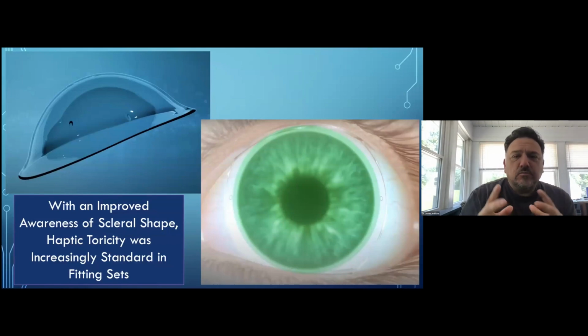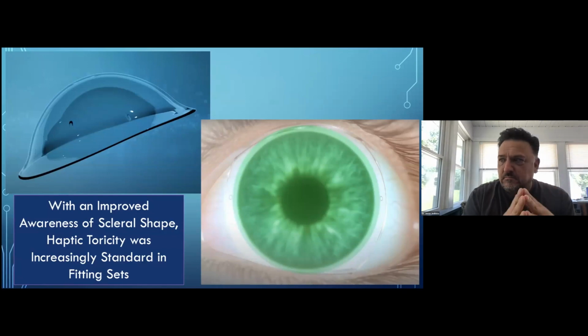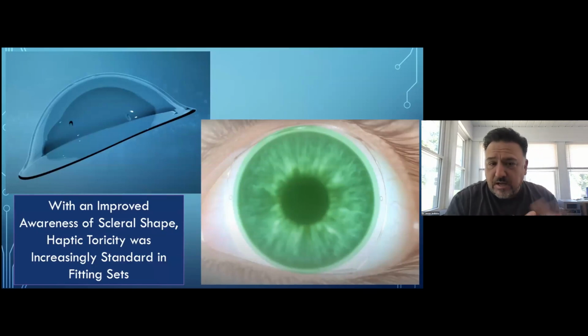As we do that, we evolve our thinking from primarily spherical scleral lenses, which I think was all I fitted for the first 8 years of fitting scleral lenses, to fitting almost everybody with some degree of toricity, to now increasingly using quadrant specific lenses or lenses with toricity internally, not just in the haptic. Our utilization of toricity and quadrant specific curves in our lenses is growing as our lathing capabilities and software improve, and as our understanding of eye shape through scleral topography improves.